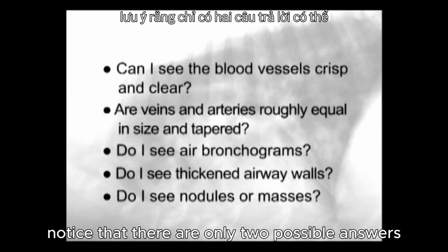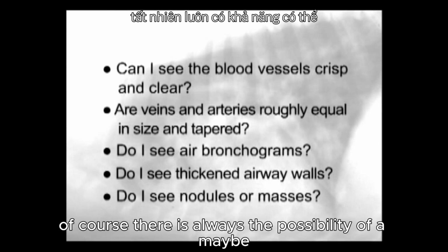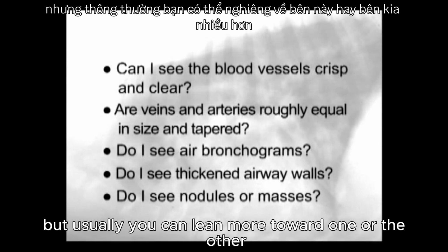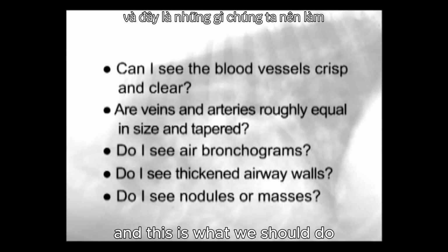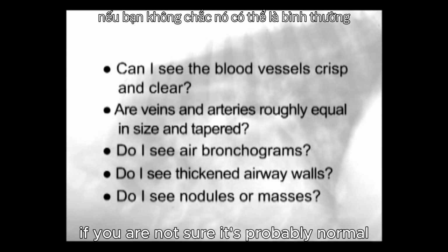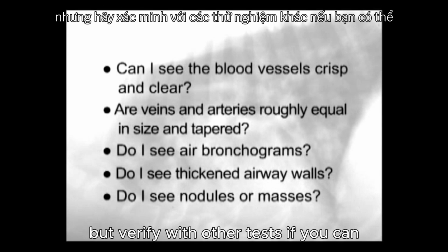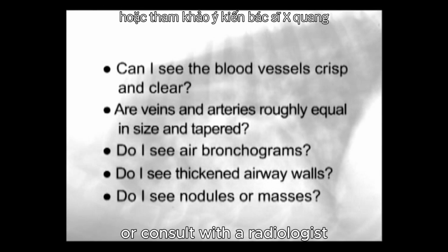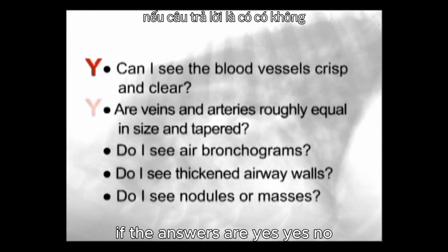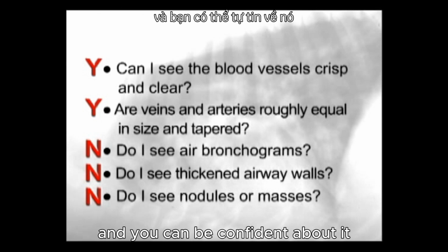Notice that there are only 2 possible answers for every question, yes or no. Of course, there is always the possibility of a maybe, but usually you can lean more toward one or the other, and this is what we should do. Our job is to make these choices. If you are not sure, it's probably normal, but verify with other tests if you can, or consult with a radiologist. If the answers are yes, yes, no, no, and no, the radiographic diagnosis is normal, and you can be confident about it.